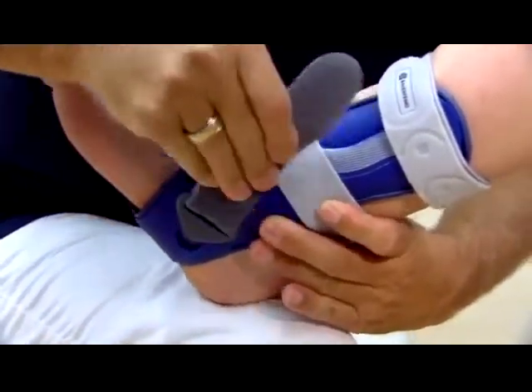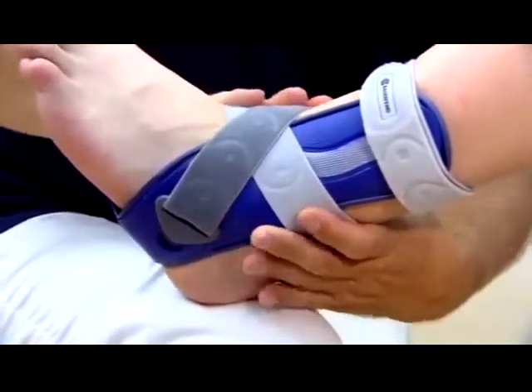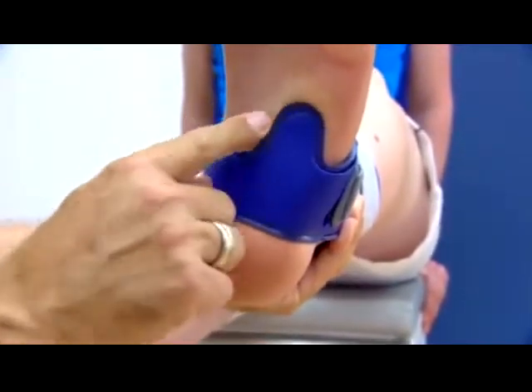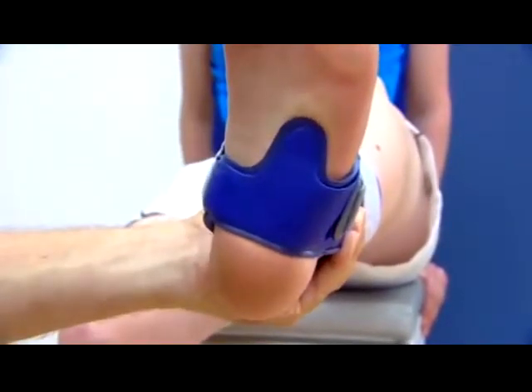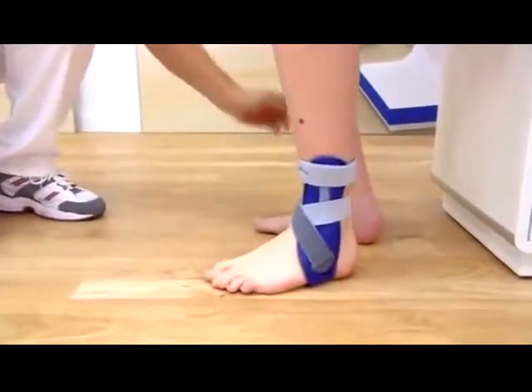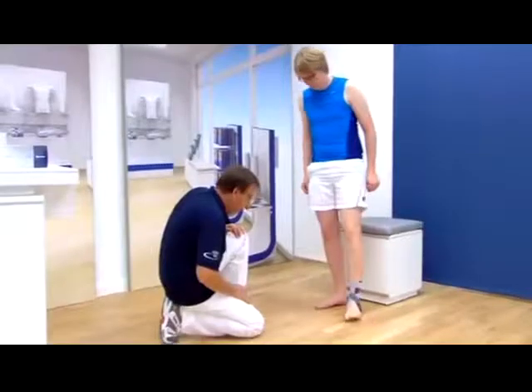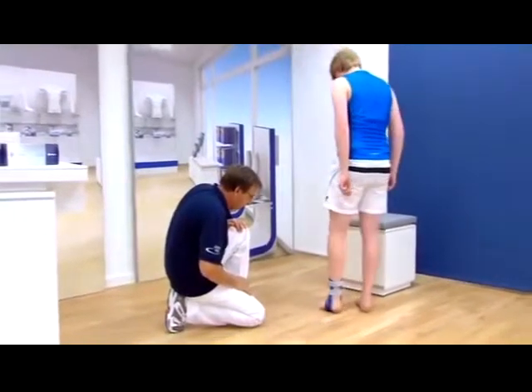The end of the lower strap is fixed into place from the bottom to the top using the eyelet and fastened with the velcro strip. The foot is then raised and checked to make sure that the tongue is not cutting in. If it is, the stimulation pad can easily be bent back. With the patient in a standing position, the straps are checked to ensure that there are no creases.